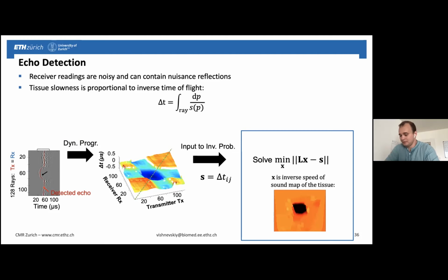But this CT matrix, the ray matrix, because we have access to the tissue only from one side, right? We have only the readings in the longitudinal direction, and we have no rays penetrating the tissue in the transversal direction. In practice, it would mean that the acquisition matrix is extremely ill-conditioned.